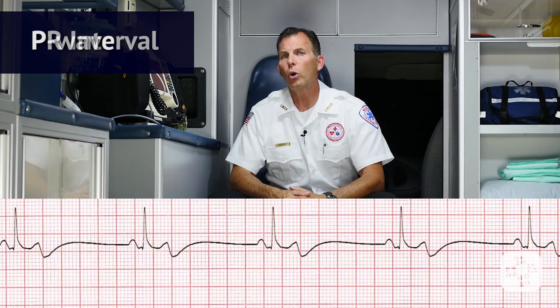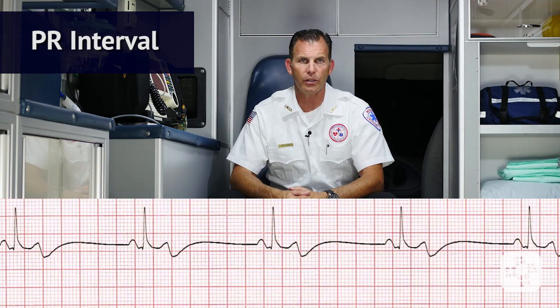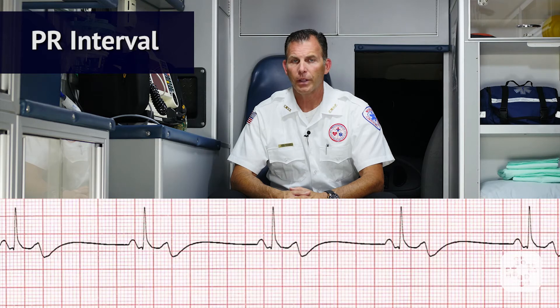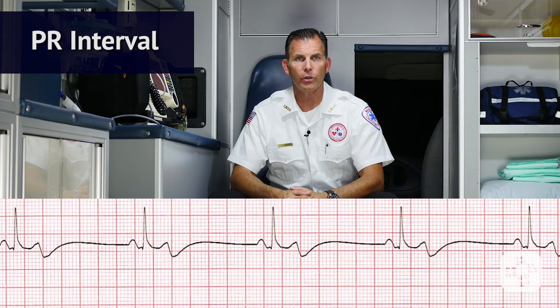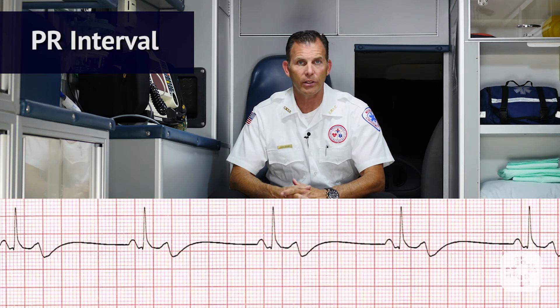Now we want to know what the PR interval is for this ECG. The PR interval is normal — it's less than 0.20 seconds. Is the PR interval constant? Yes.